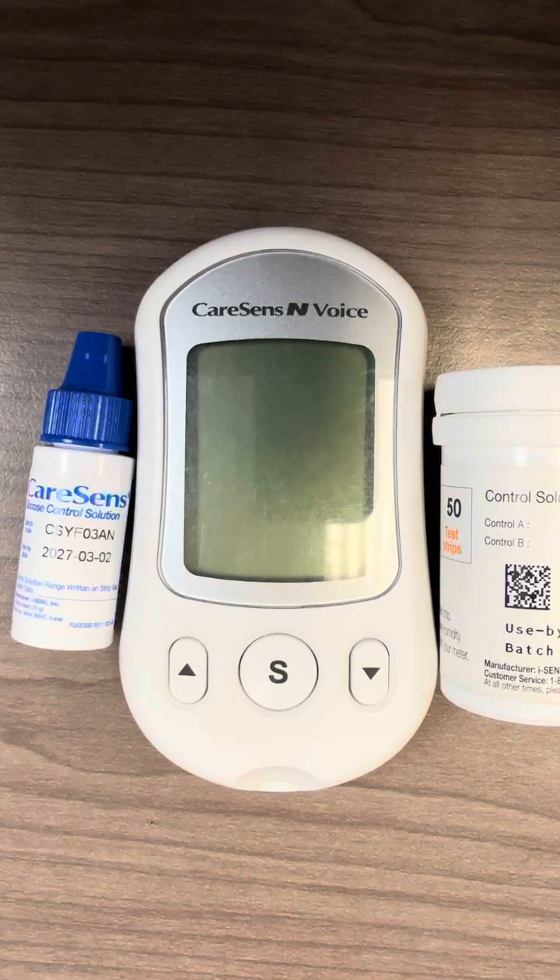Hello, this is Sun from i-SENS USA. This video is about how to run control solution testing with CareSens N Voice.